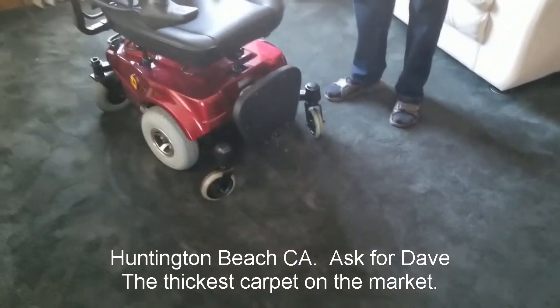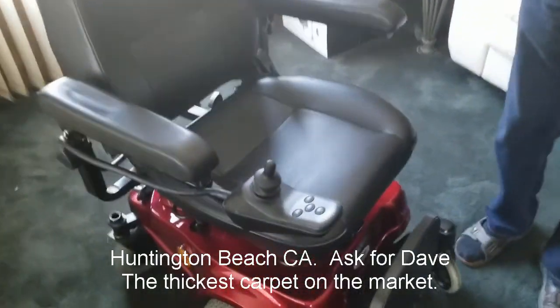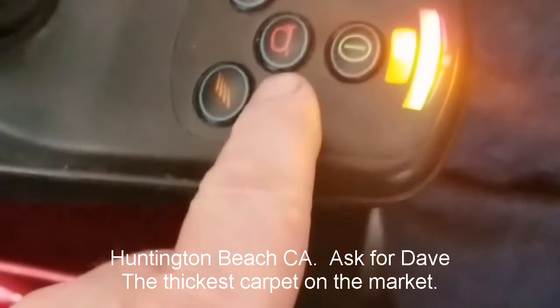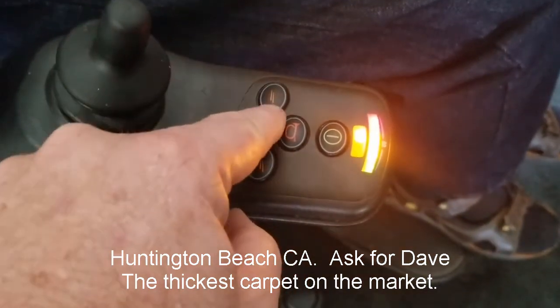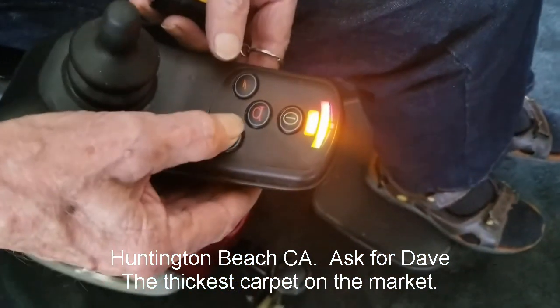Now we're going to take it for a spin so you can see. You turn it on by pressing this button, and it has various speed options. And it has even a horn. That's a speed control — that's slow, this is faster. You can tell by the light. That's as fast as it goes.